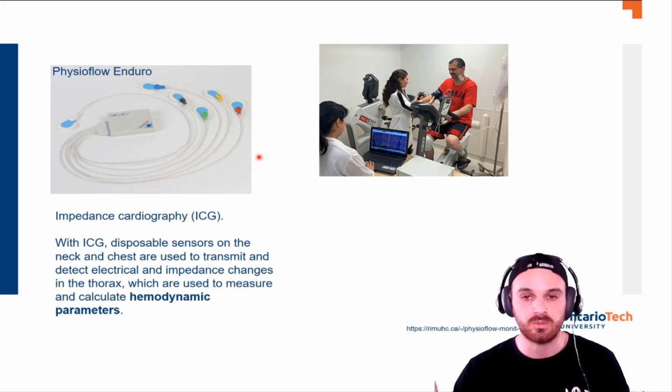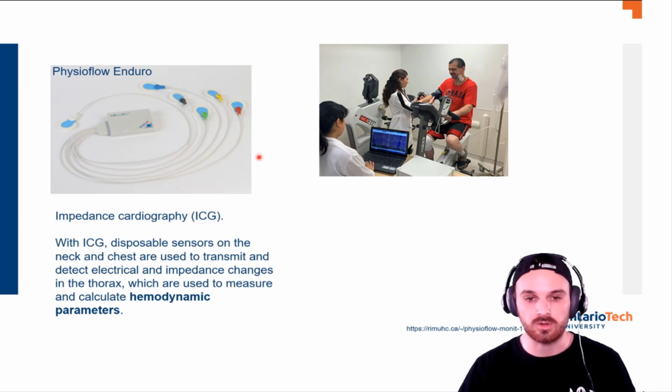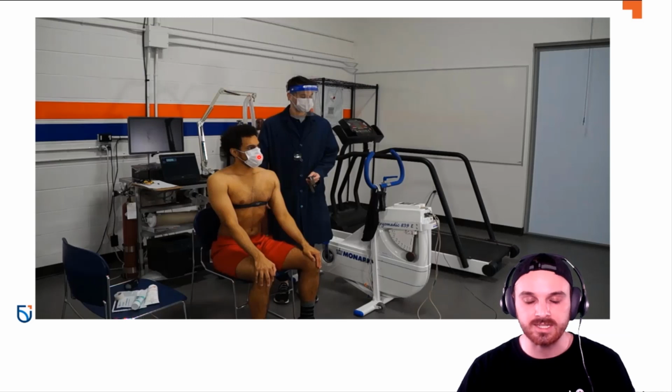very important. You'll see I put in this test resting blood pressure, because the actual pressure of the blood moving through will determine how much actual volume there is. So it infers how much volume there is and gives you a stroke volume output. Stroke volume times heart rate is your total cardiac output. So that's how that does that.